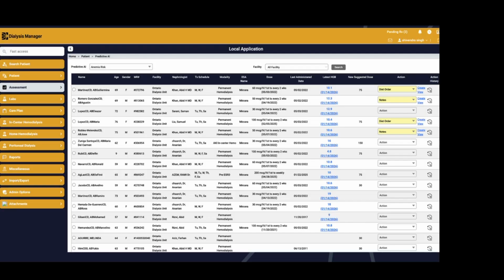And not only that, we can achieve up to 8 to 10% of dose reduction and direct cost savings on the medication used. And I think many would say that cost savings on Mircera also equals better outcomes for patients, right? Because if we can keep the patient's hemoglobin stable while using less drug, I think that's better for cardiovascular health and fistula health.